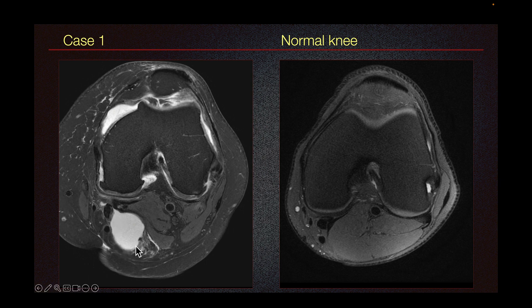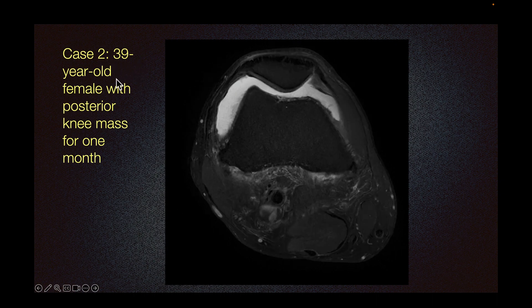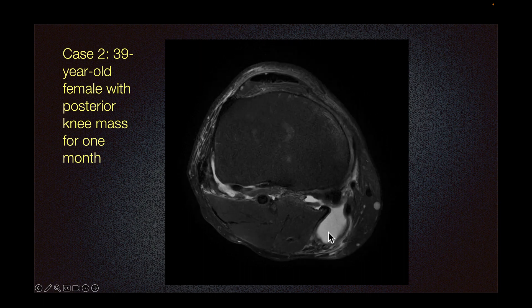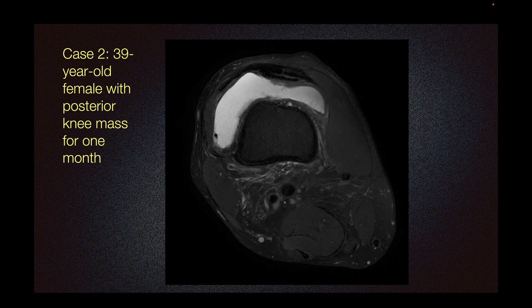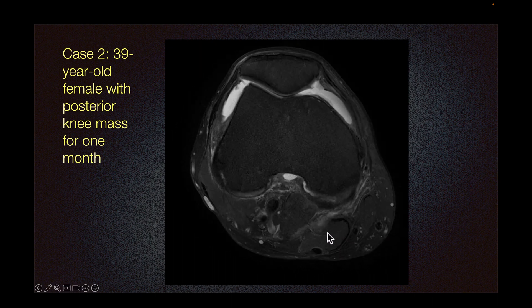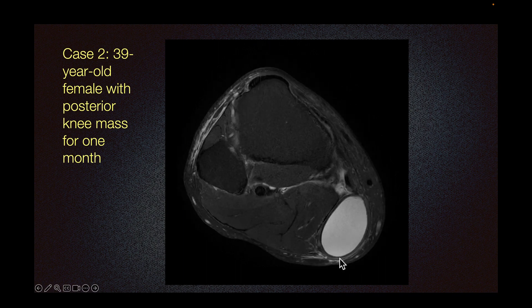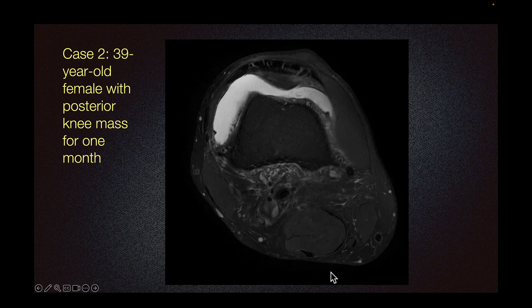Here we can look at the Baker's cyst in our case. This is a normal interface between the medial head of gastrocnemius and the semimembranosus. I have one other case of a 39-year-old female with posterior knee mass for one month. Here we can see a cyst between the medial head of gastrocnemius and semimembranosus. As you go down, this is semimembranosus, this is the medial head of gastrocnemius, and we can see the cyst in between. We also see edema around the cyst, indicating that this cyst has leaked or ruptured.